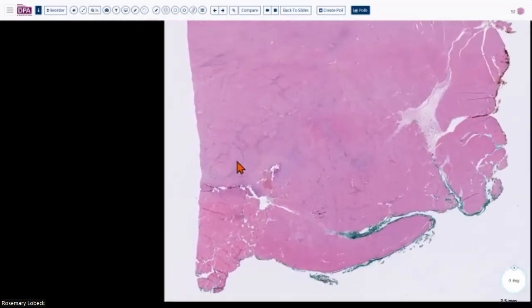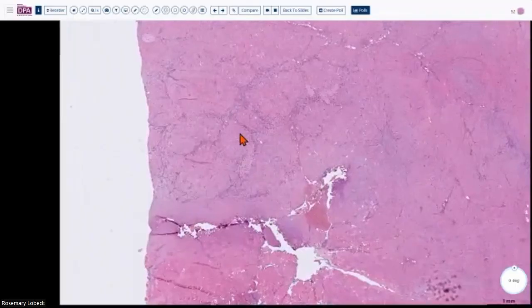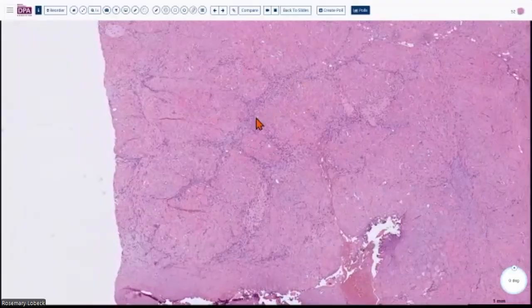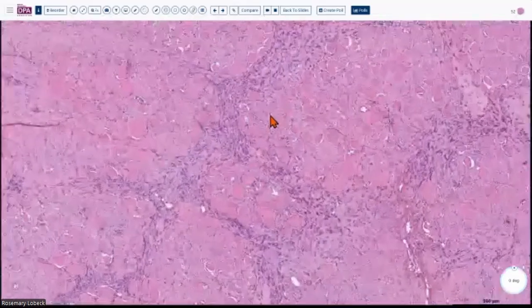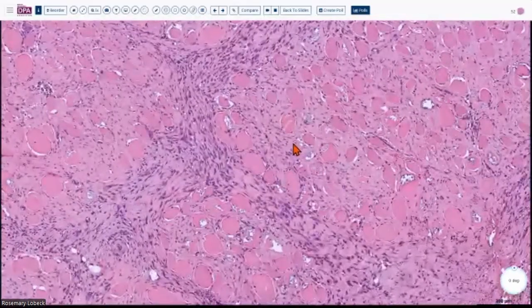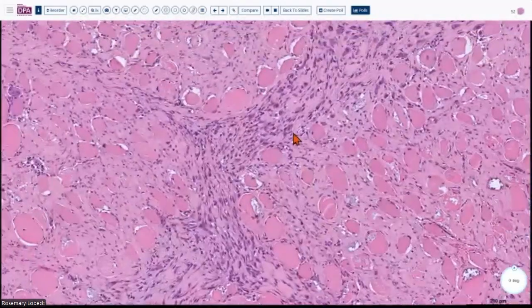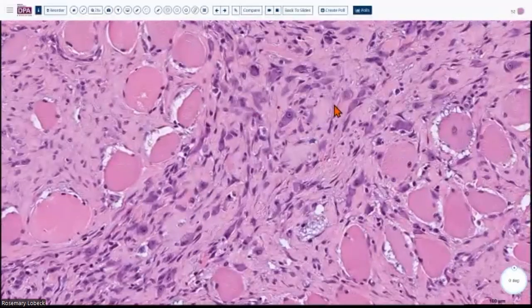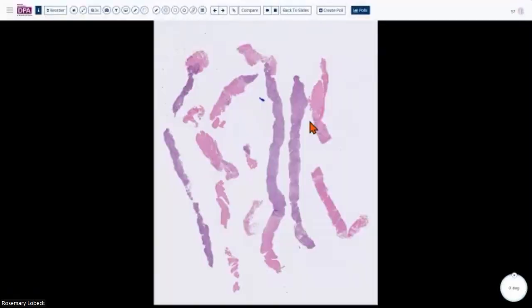So you can see here that typical checkerboard pattern that we talk about in proliferative myositis. So you can see muscle bundles and then this type of myofibroblastic proliferation. This is a macro checkerboard, and then if you go closer, you will see what we saw in our biopsy, like the micro checkerboard, where you see this myofibroblastic proliferation going in between individual muscle bundles. And similar to that case, if you look at this, you will see these ganglion-like cells, right? So that's a clue for proliferative myositis.